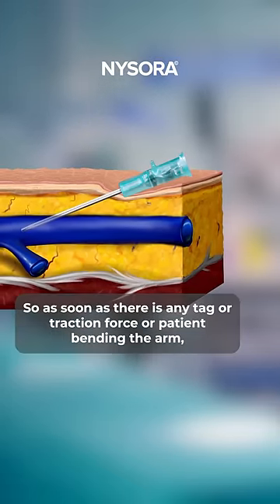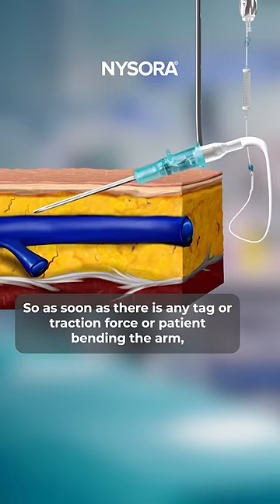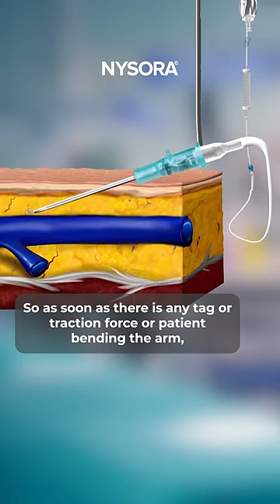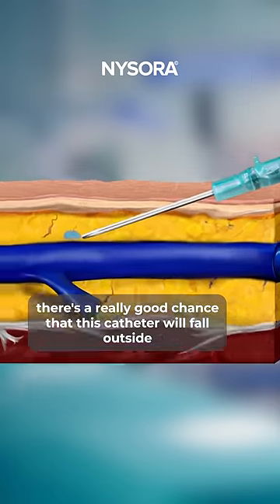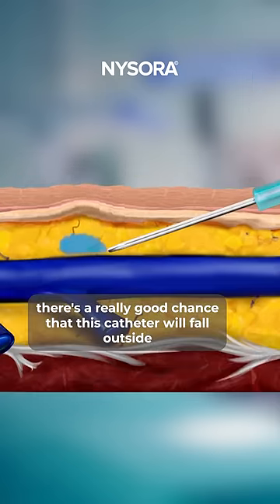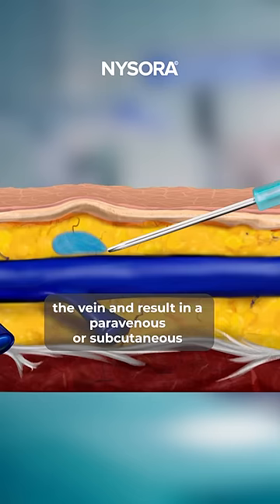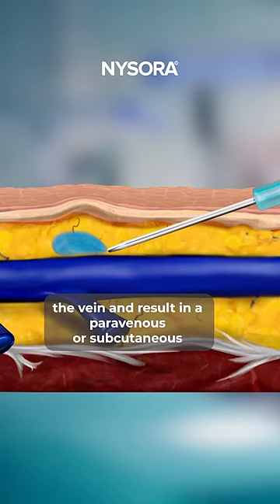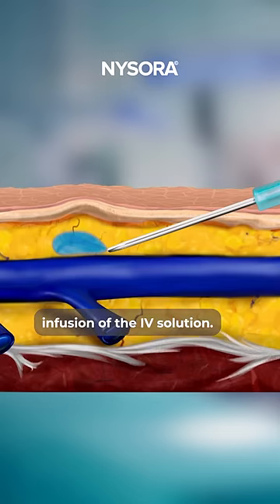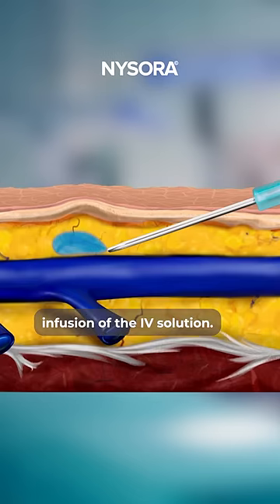So as soon as there is any tag or traction force, or the patient bends their arm, there's a really good chance that this catheter will fall outside the vein and result in a paravenous or subcutaneous infusion of the IV solution.